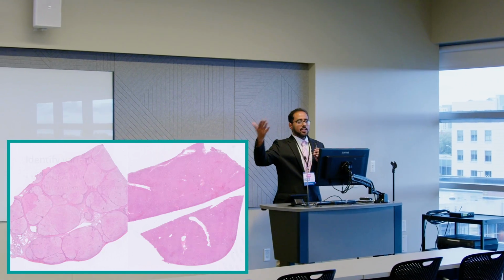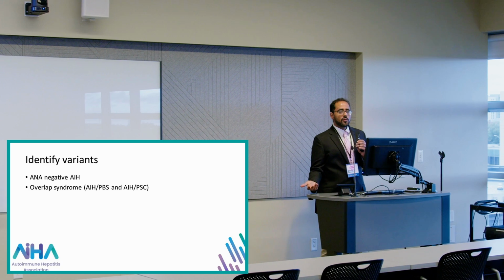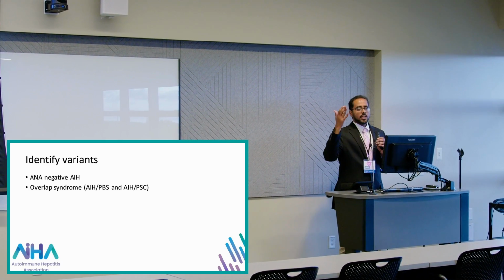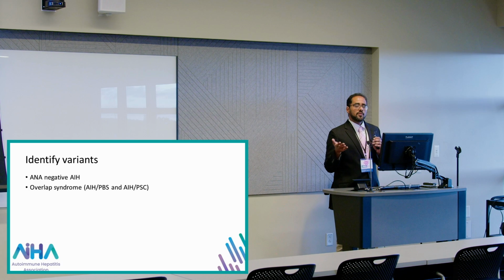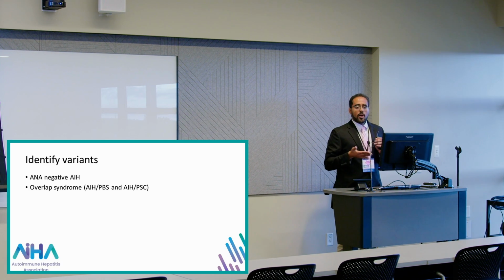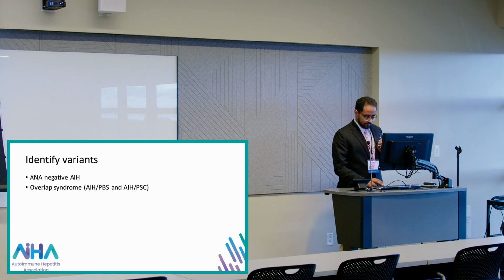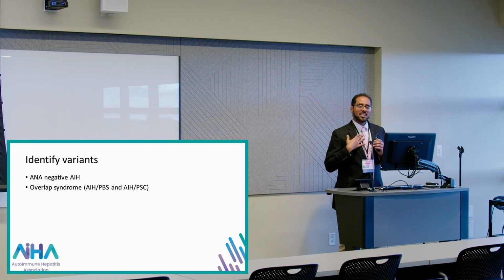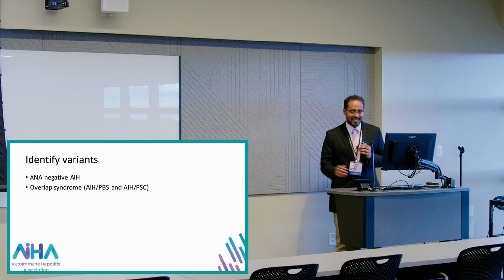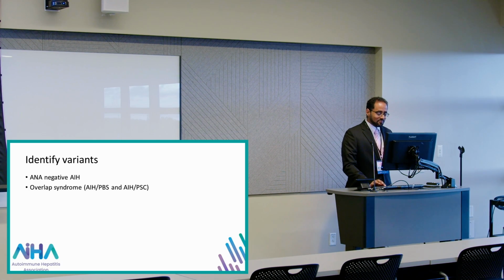So that's the grade and the stage. These are the second set of information we provide for the hepatologist. First, yes, this is autoimmune hepatitis, and then how far in the process of damage it is. Grading, severity, and then staging, the amount of fibrosis we have. And I'm pretty sure they know what to do with that information. Just don't ask me. I just know how to provide that information for them.